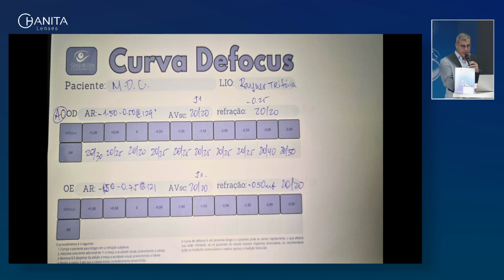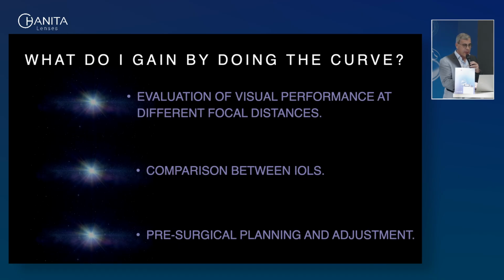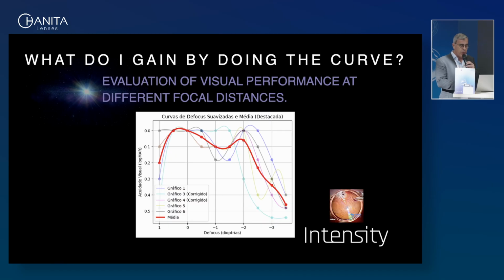This is another IOL from another company. I do this for every IOL I implant. And what do I gain by doing the curve in my clinical practice? I can evaluate the visual performance at different focal distances, and I get to compare the IOLs to see how they perform in my clinic, in my practice. And it helps me a lot to adjust my surgical planning, and I'll show you why.